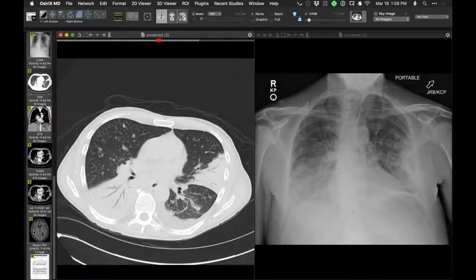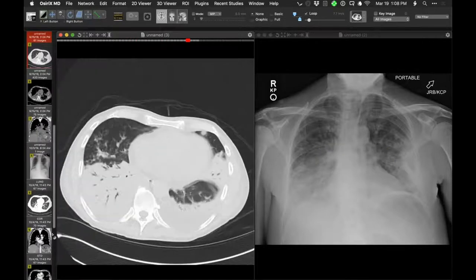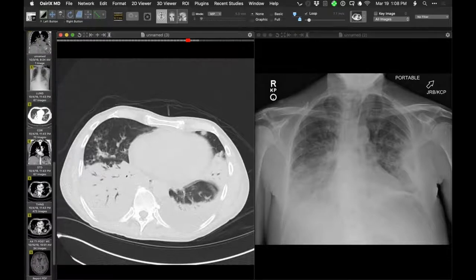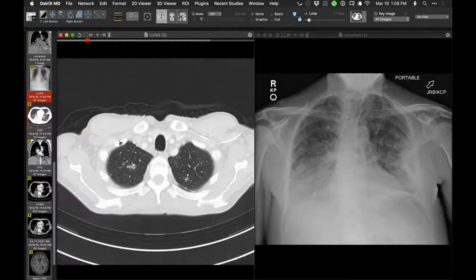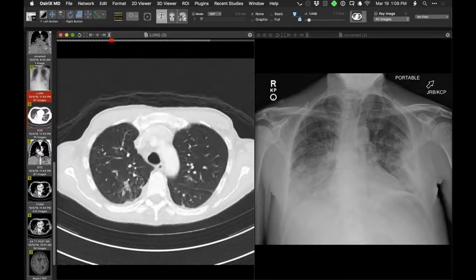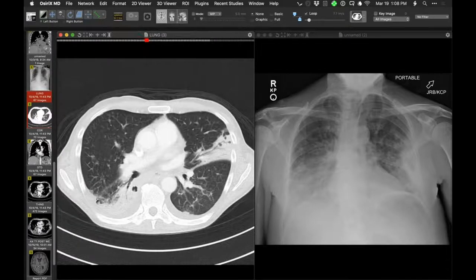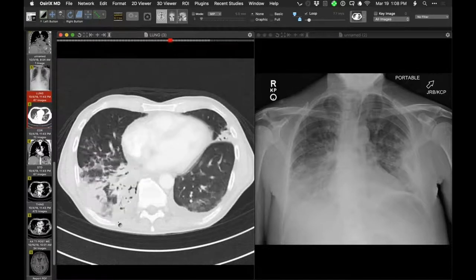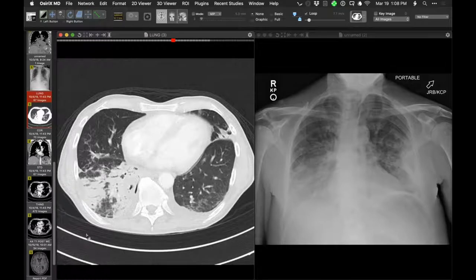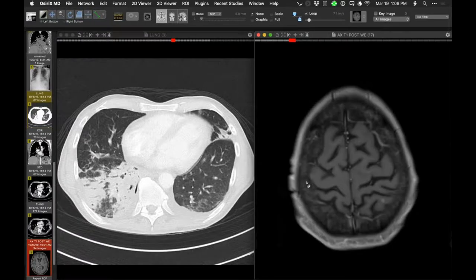And I will show you that with complicated findings a little bit later. Let me see, this CT is 9:15, but the patient was not doing well. And here we go to October 4, at which time we do see, again, focal nodular opacity. So that's one pattern, as well as that, maybe a cavitary nodule, as well as, for sure, a necrotizing consolidative process, mostly in the right lower lobe. And then the patient also had this. So here is an MRI on the 15th.